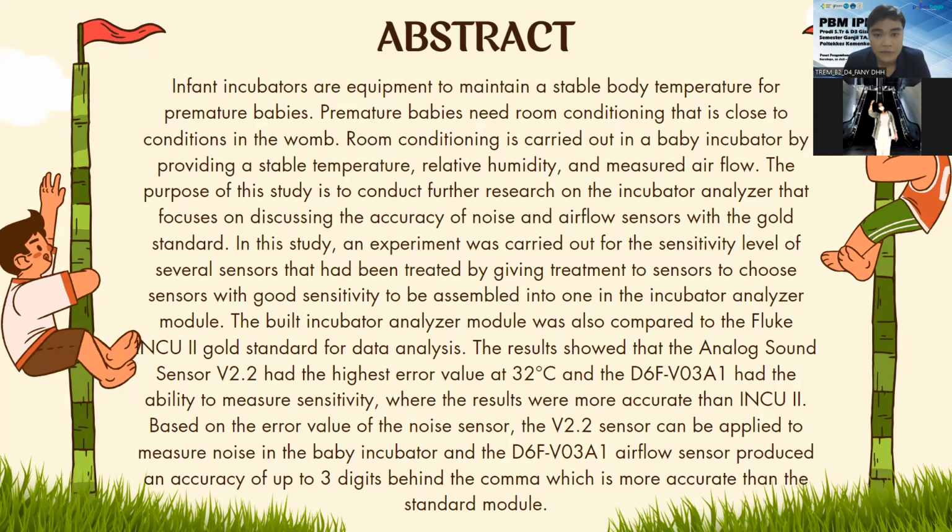In this study, an experiment was carried out for the sensitivity level of several sensors by giving treatment to the sensors, to choose sensors with good sensitivity to be assembled into one in the incubator analyzer module. The built incubator analyzer module was also compared to the Fluke INCU II gold standard for data analysis.